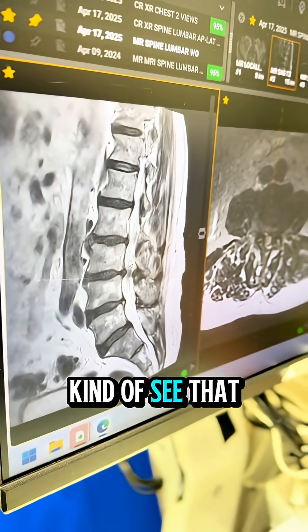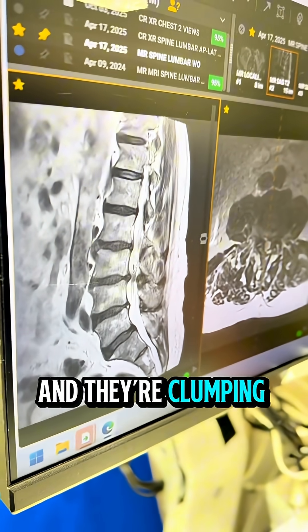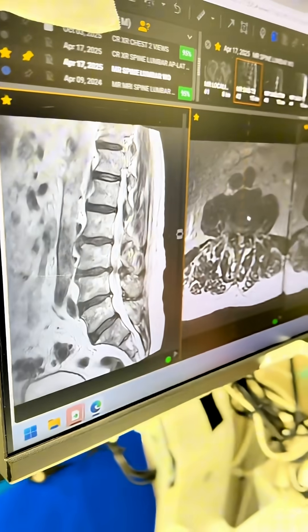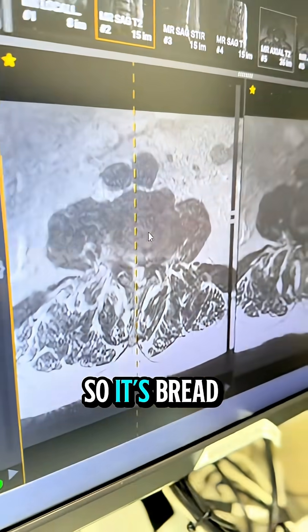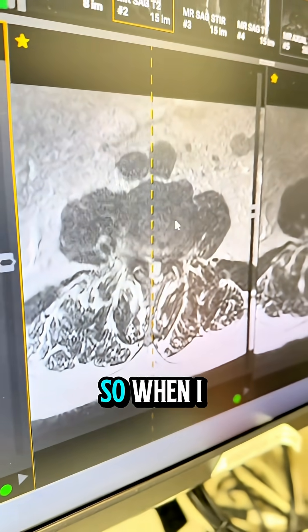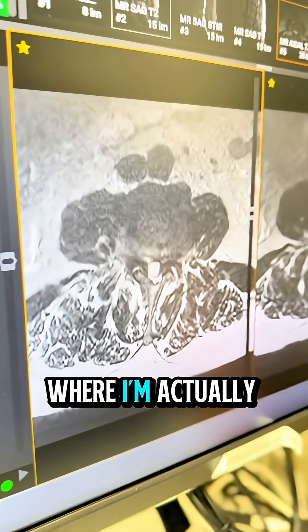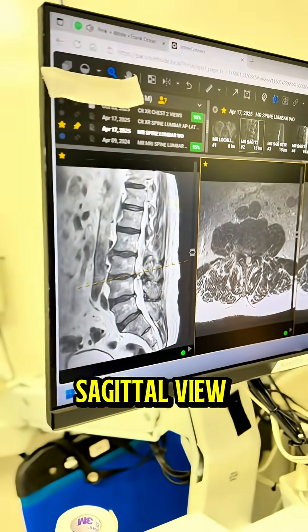You can kind of see that these nerve roots are redundant and they're clumping above what we call stenosis, or narrowing. This is an axial view — like bread slices all the way down. When I click on there, you can see where I'm actually at on that sagittal view.